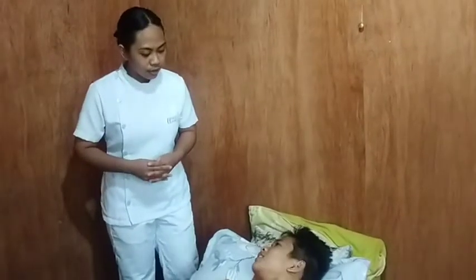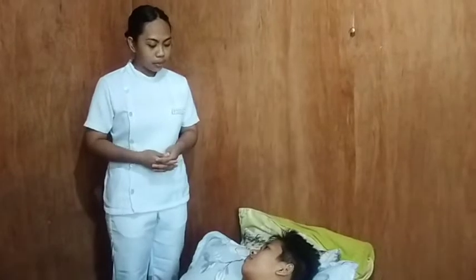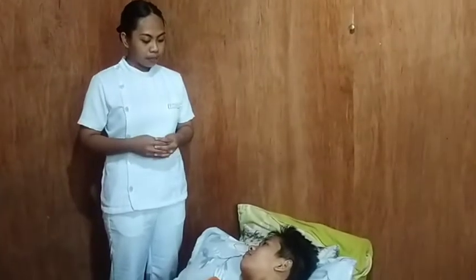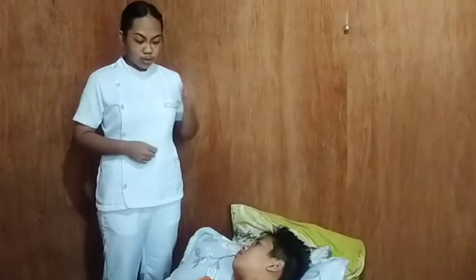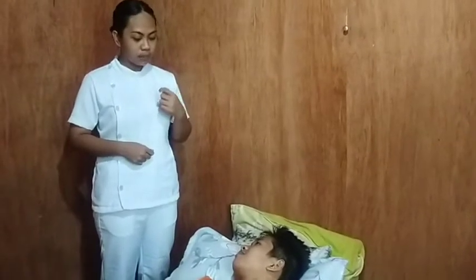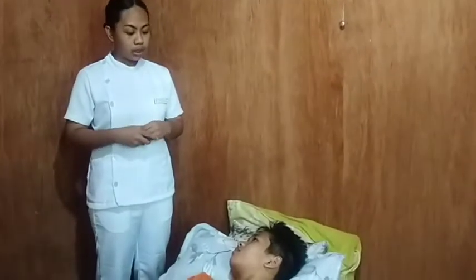Good afternoon, sir. Sir, ako day si Lenny Grace Banoy, yung nurse karon. Karon, sir, mag-perform ko og inserting nasogastric tube in GT. So, isubsub na ko na siya sa imong ilong, sir, no? Then, nalang ko yung mga ipabuhat sa imong unya during insertion.